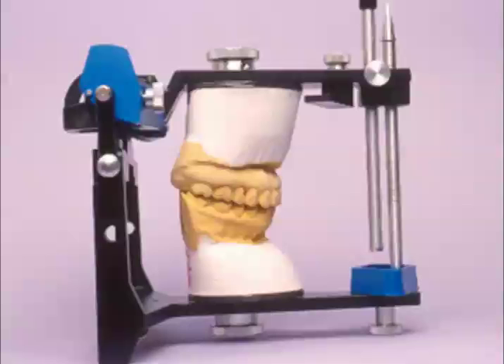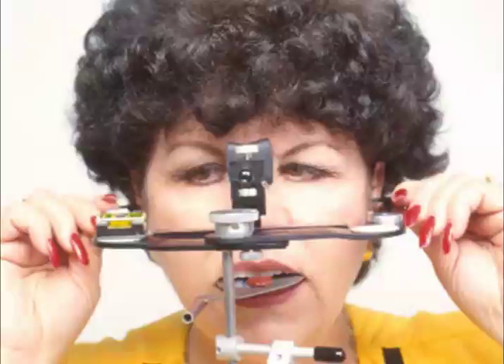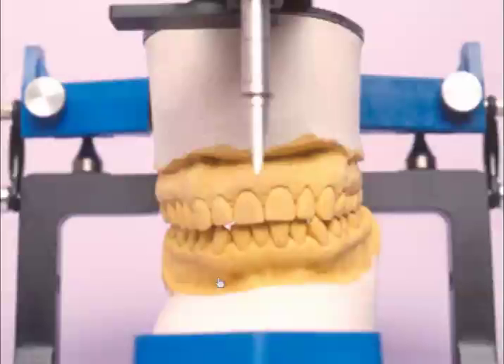So if we could look through the patient's cheek here and see the steepness of her plane of occlusion, we get the same result on the articulator. And looking at the frontal plane, we can see a cant to the occlusal plane running downhill from left to right. We'd get that same look on the articulator when we mount the cast. So now we can do an evaluation of whether we want to do some gingival recontouring on this side for symmetry and balance, whether we want to prep more on this side or add back to this side to level the plane of occlusion for both function and aesthetics.